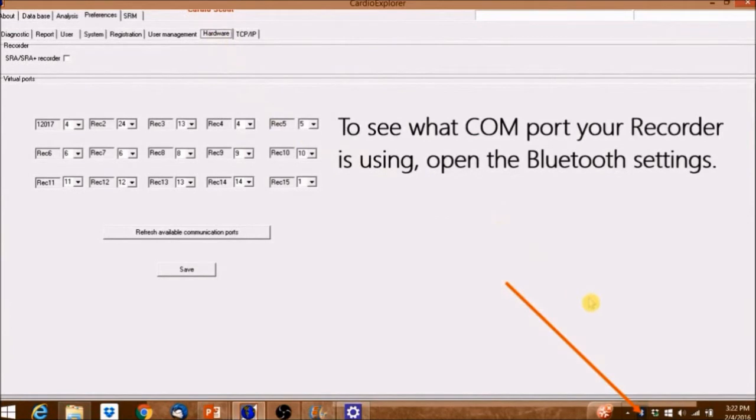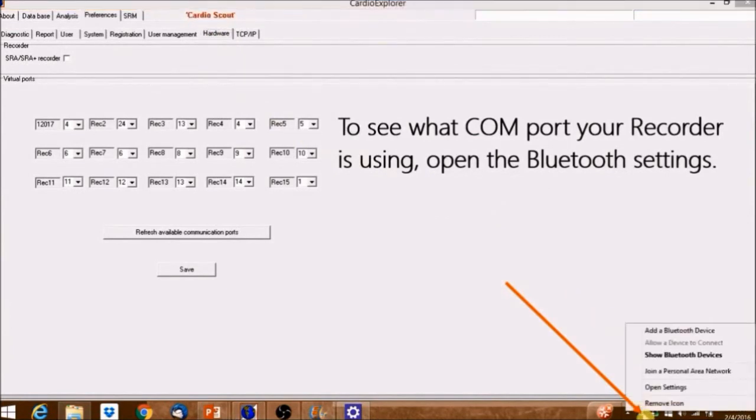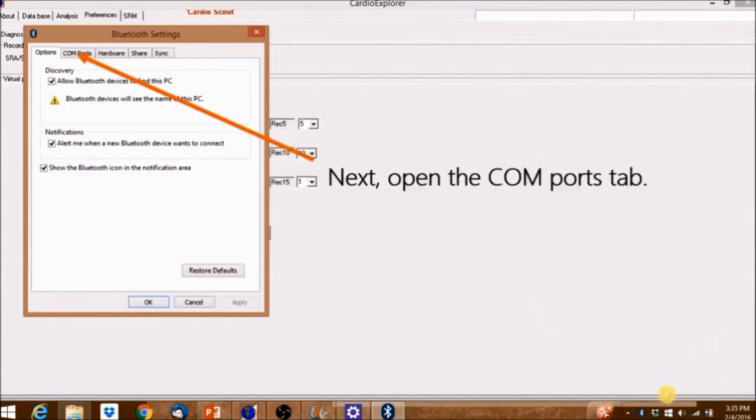To see what COM port your recorder is using, open the Bluetooth settings. Next, open the COM ports tab.